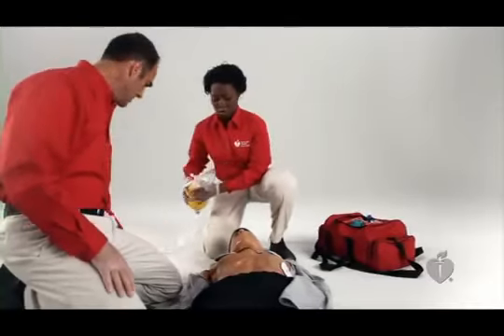Be sure that no one is touching the victim, not even the person in charge of giving breaths. Ideally, you will pause CPR during or immediately after a set of compressions. Some AEDs will tell you to push a button to allow the AED to analyze the heart rhythm. Others will do that automatically. The AED may take about 5 to 15 seconds to analyze the rhythm.